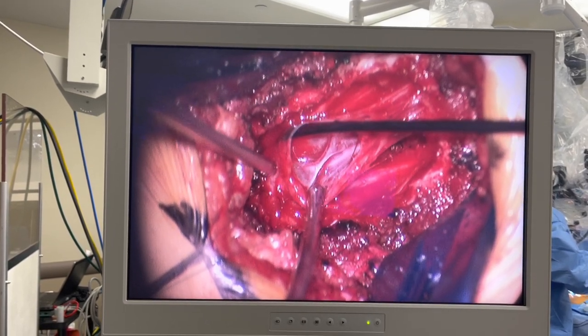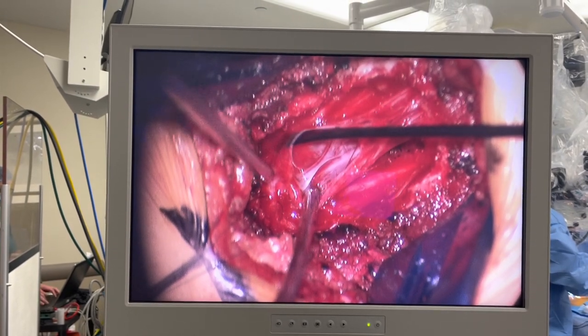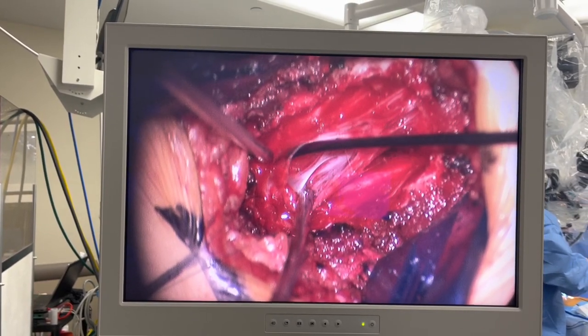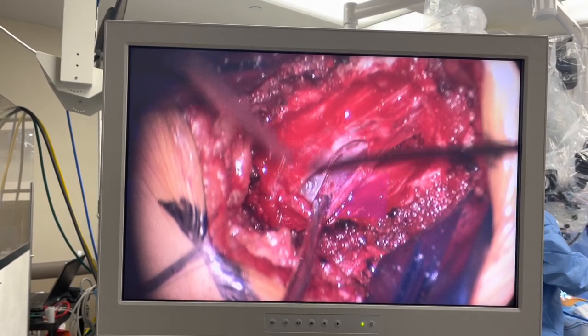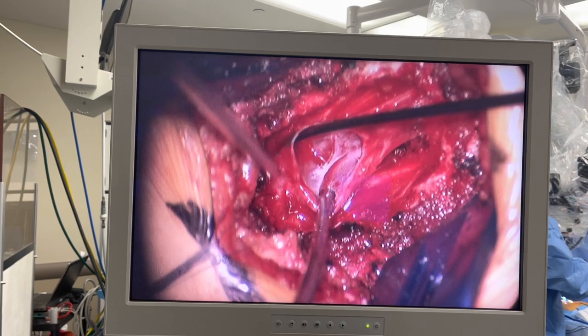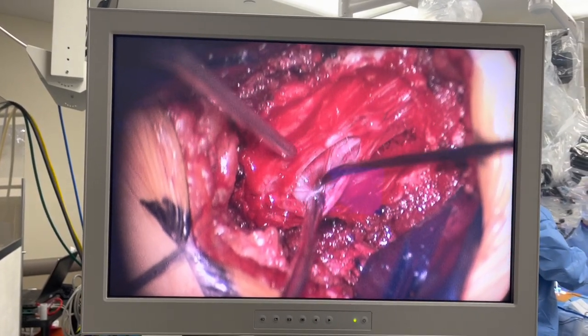Can you do a Valsalva? Yeah, sure. Watch this with the Valsalva. That's going to get really big. All right. Ready? Go. Valsalving at 25, 25, 25. Look at that thing. 25. See that? It's a cyst within a cyst right there. Can you suck right in here? I'll let go. Okay. And then it collapsed when she let go.